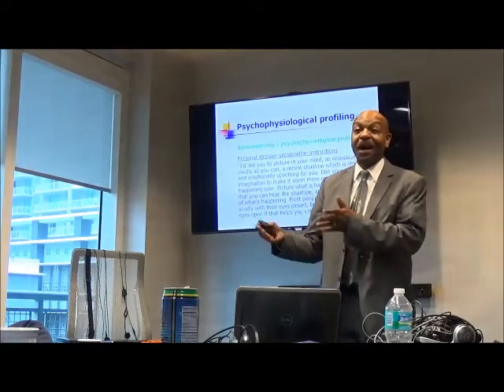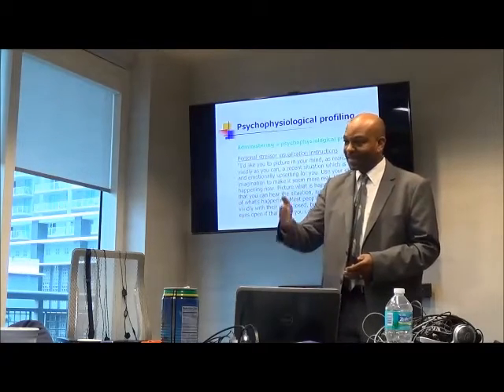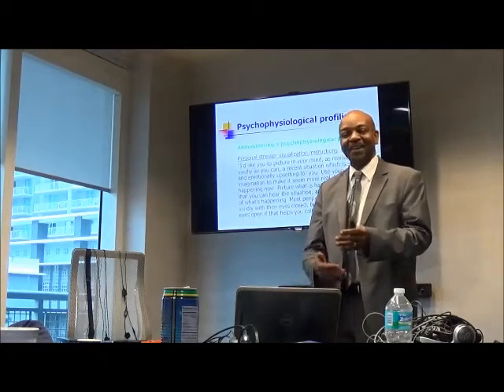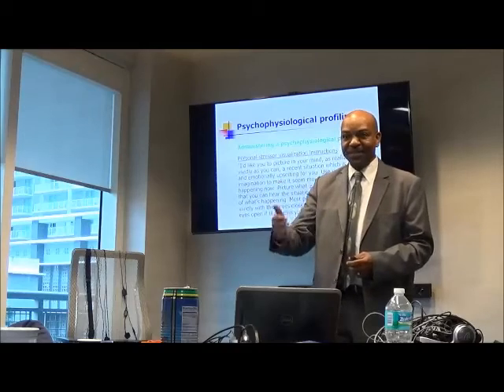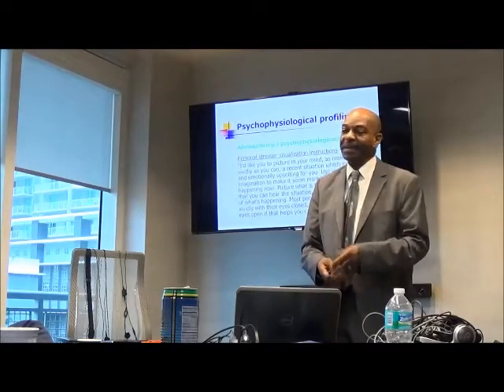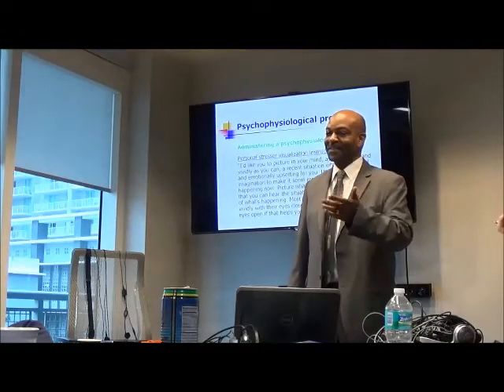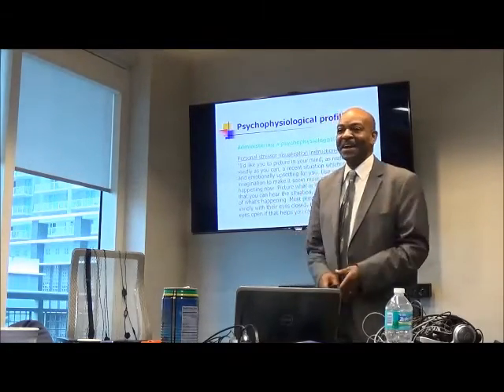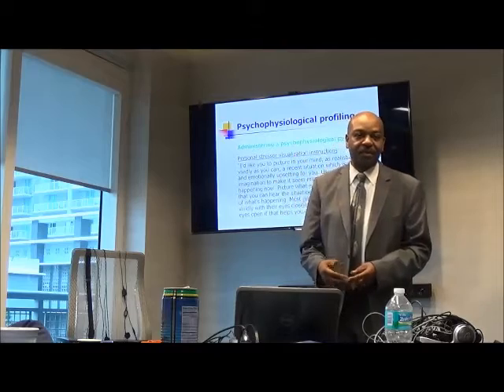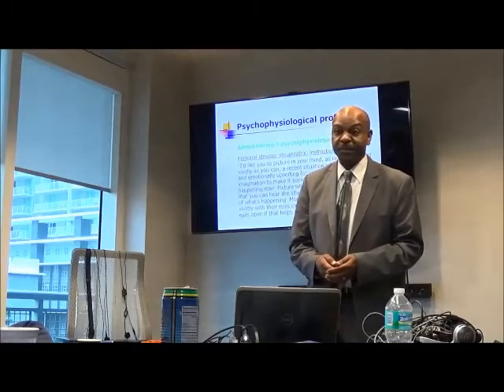And the opposite is that they want to keep talking and keep talking, and the time to stop talking is there, but they're not finished with their story and they want to keep going. So you have to, in a gentle way, tell them that you need them to stop for now. And when you finish with the test, they can finish telling you. And that's what I usually do, so that if they're not finished with the story, they don't feel insulted that I didn't really care about their story. I just want to do my test, you know. So then after we finish, I say, so then you can finish telling me what happened now. So those are some of the things that you want to think about with the stress assessment.